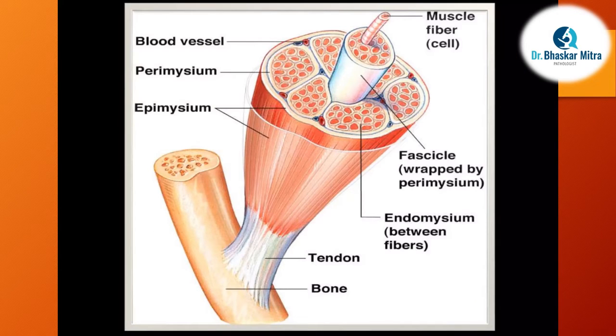It looks like fascicles, and these are the different short cords of this whole cord. So this is the fascicular arrangement, what we exactly see in the muscle bundles. These are the bundles of muscles arranged in fascicles, surrounded by the perimysium.